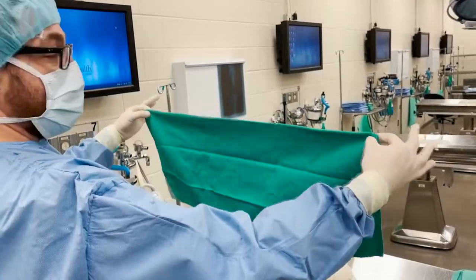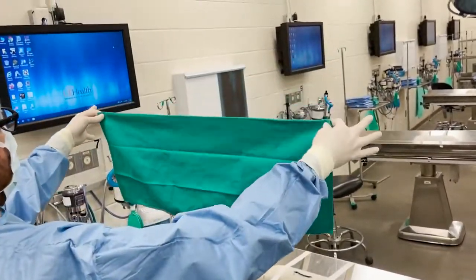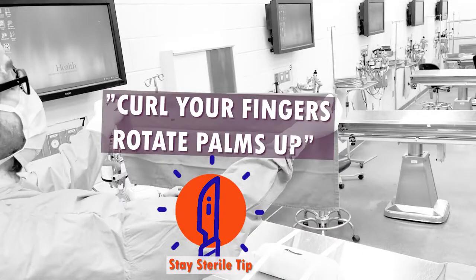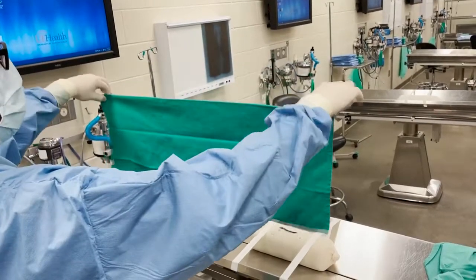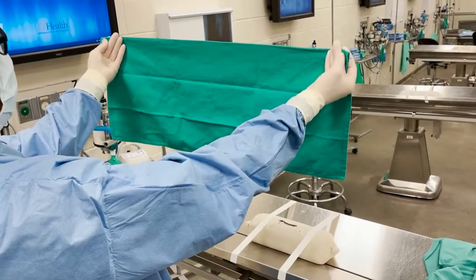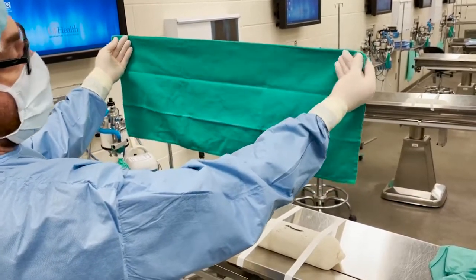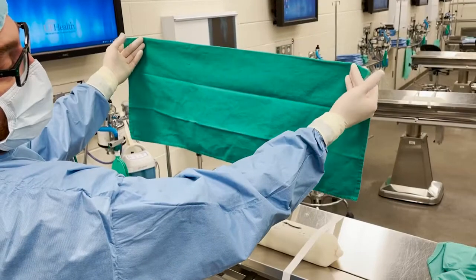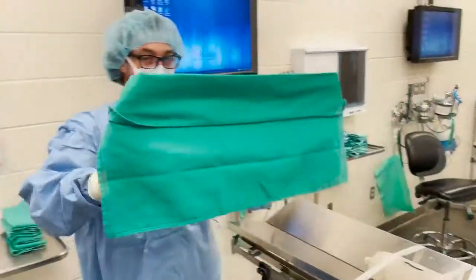You've got it like this, and then the next thing is to curl your fingers in like you're making a fist. Then bring your palms up — this is where I'm rotating my fingers but not pinching. If I pinched, it would look wrong. I just want to rotate my fingers, get my palms up, then flip my fingers back. Adjust so your fingers aren't peeking up over the top — keep them a little hidden — then rotate your wrist. Your thumb can let go because you're pinching with the other two. Now I have a completely protected hand.